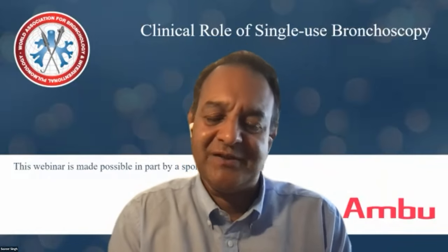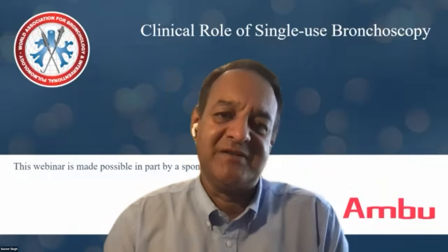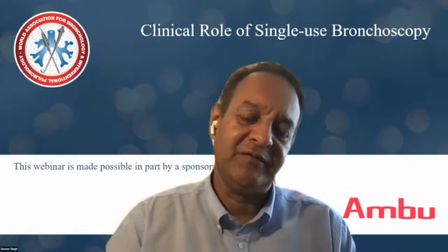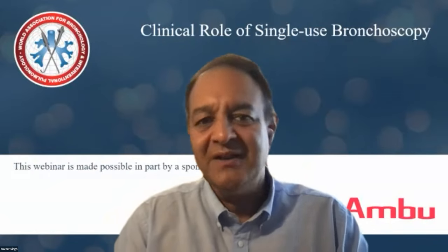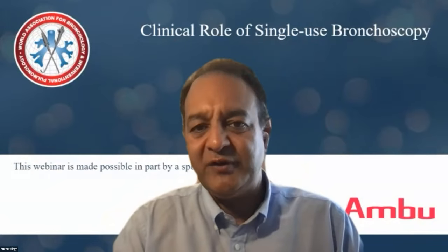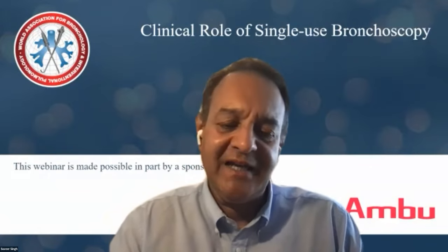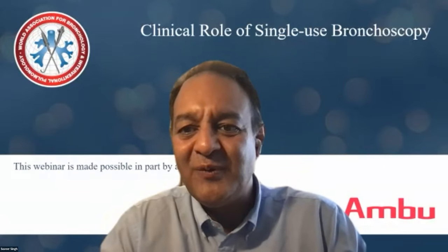And in certain situations, one could almost pseudo-legislate and say, look, this is a complex procedure. It's more likely to lead to risk, a tracheostomy, for instance. That's where we're going to use the single-use scope. If you need better visualization, there's concern about an underlying malignancy or something unusual, maybe that's where, from a diagnostic perspective, you want to use the better imaging of the reusable. But these are the refinements that we are going to have to think about as we adopt this symbiosis of reusable and single use. Exactly.